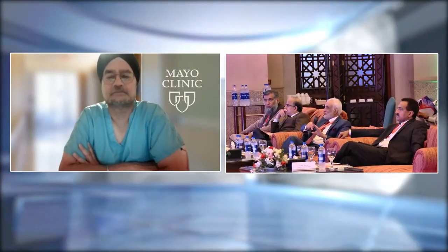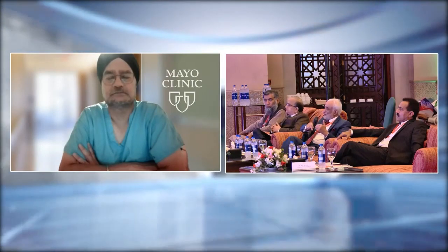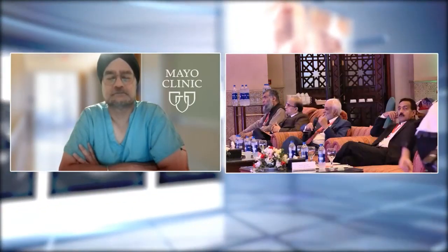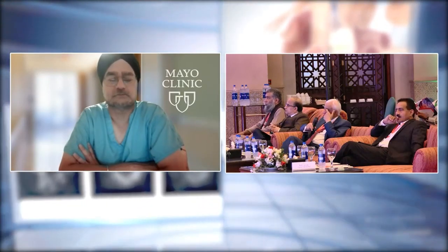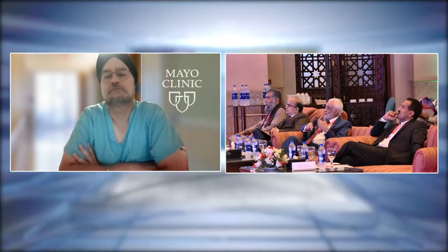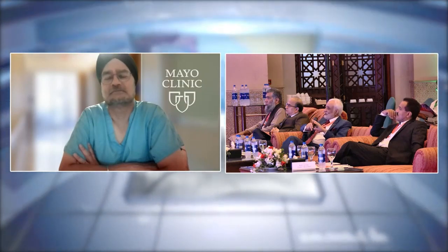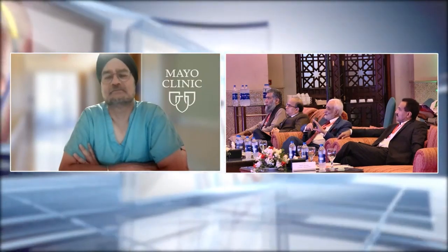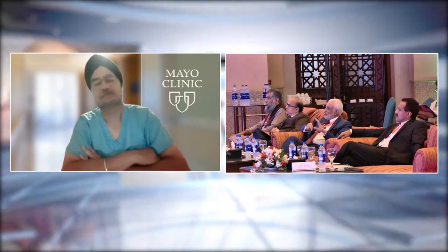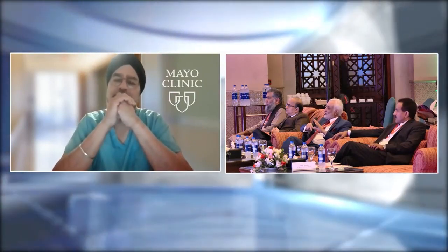When you're selecting the different kinds of valves for a patient for TAVI, what are the criteria that you have, for example, regarding the takeoff of the aorta, horizontal, or where the angle is much less? That's number one. And number two is, if you have calcification only on one cusp, and the other cusp is free of calcification, does that also hamper your TAVI procedure? And in such a case where there's a bicuspid valve, what would be your approach?